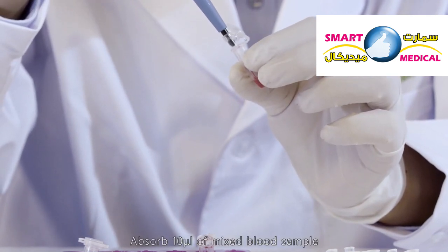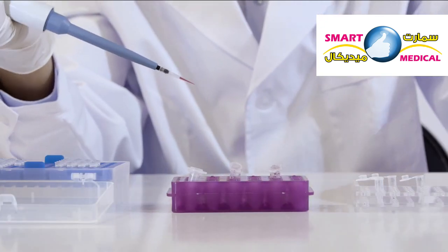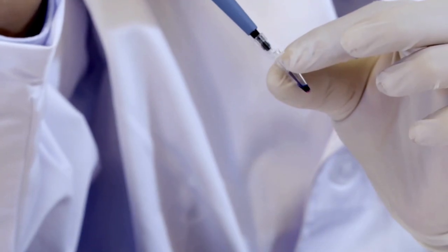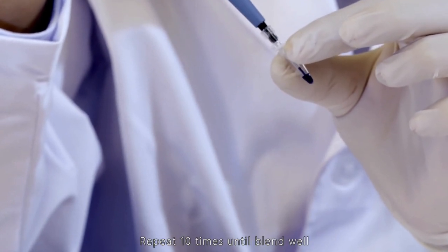Absorb 10 microliters of the mixed blood sample. Inject it into the micro centrifuge tube with the staining solution. Suck up and drain the mixture, repeating 10 times until well blended.